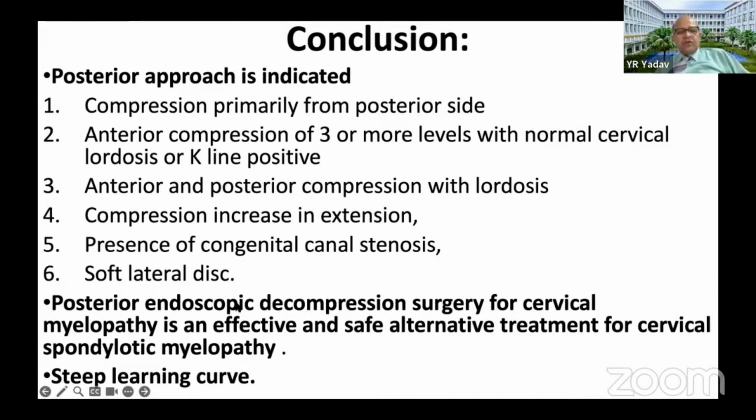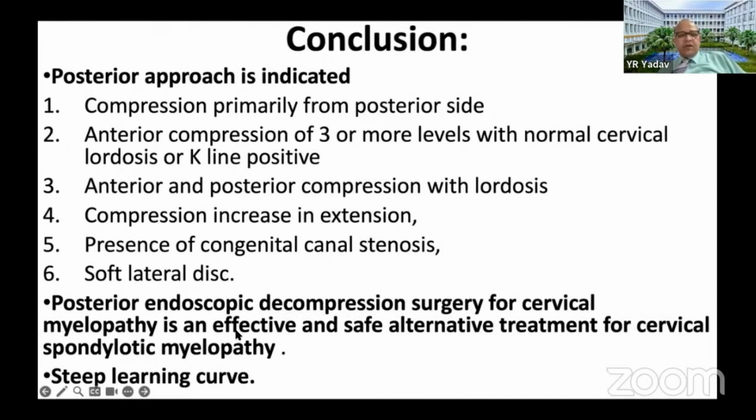So posterior endoscopic decompression surgery for cervical myelopathy in the spondylotic cases is an effective and safe alternative, but there's a little bit of learning curve which one should overcome.